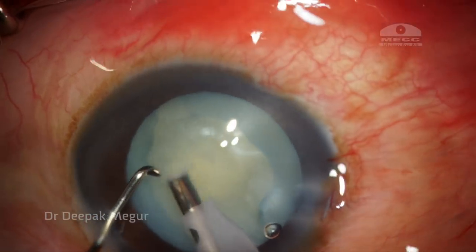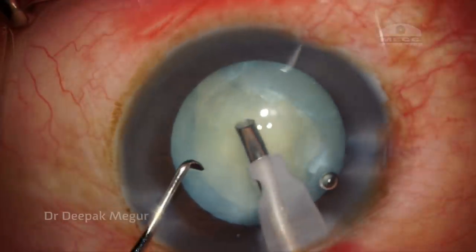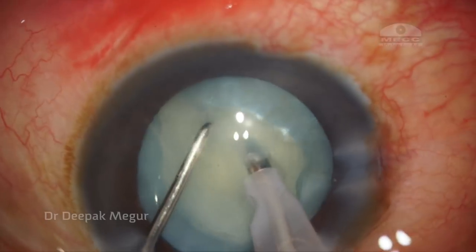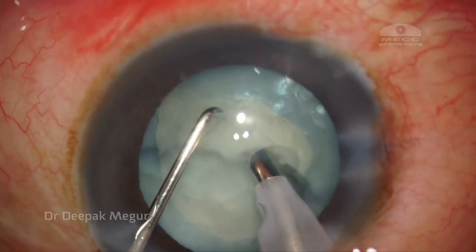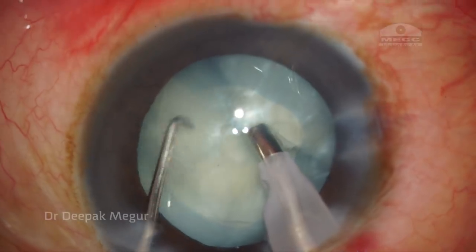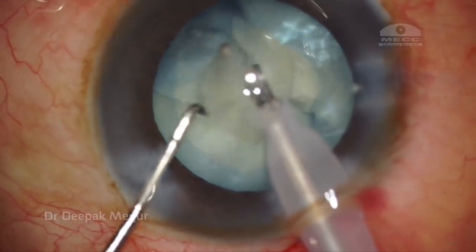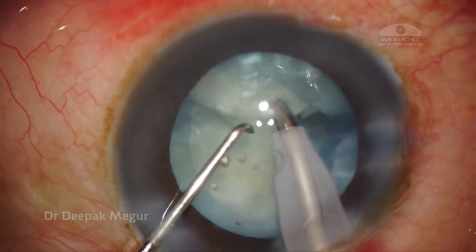So I'm aspirating a little bit of epinucleus initially, and then I plan to proceed with my direct chop. The nucleus is very soft, so I'm taking enough care to ensure that my maneuvers are as little and as gentle as possible during the chopping and lateral separation. This minimizes the chances of the posterior extension of the anterior capsular tear. Since the nucleus is very soft, it's really very easy to just split it open and then emulsify it.